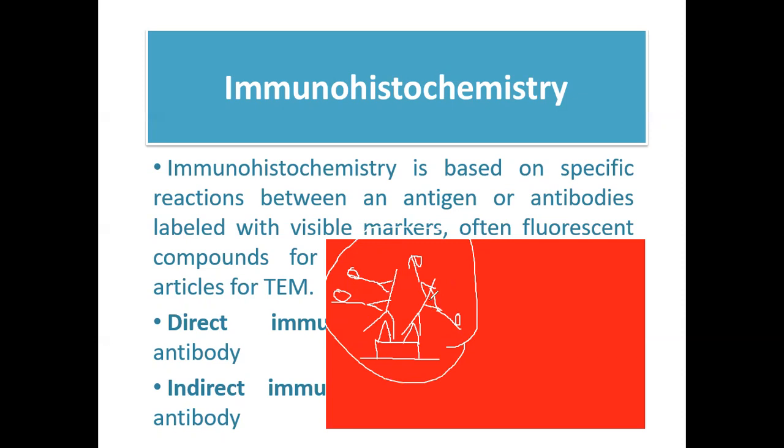Bakit sila yung labeled, di ba? So, pwedeng madaming antibodies yung kakabit dun sa primary antibodies natin. We're referring to the labeled secondary. Unlike dito sa direct, maalala nyo yung direct, if this is the specimen, pareho tayo merong dalawang antigen. Di ba, nade-detect natin yung presence ng antigen by using only a single antibody and that's your primary antibody. Siya yung labeled. Yan.